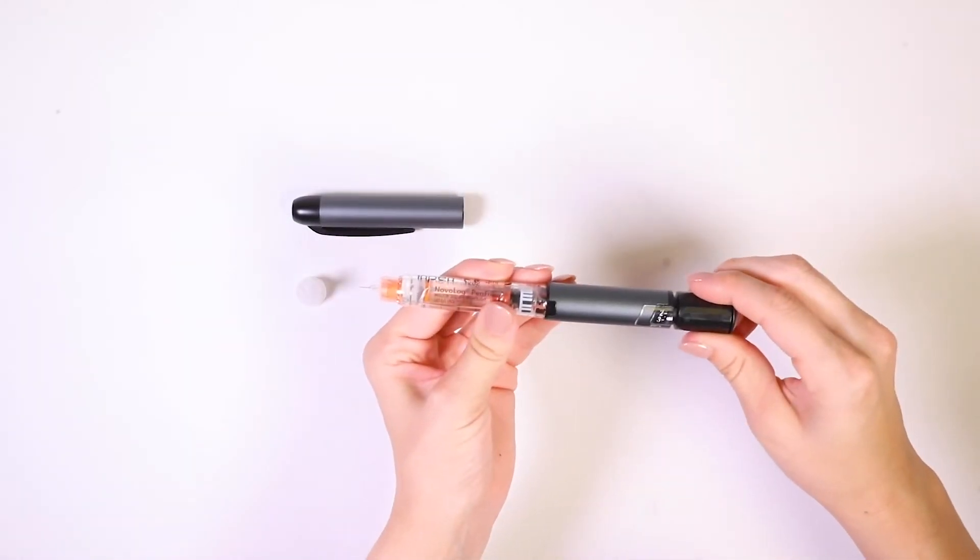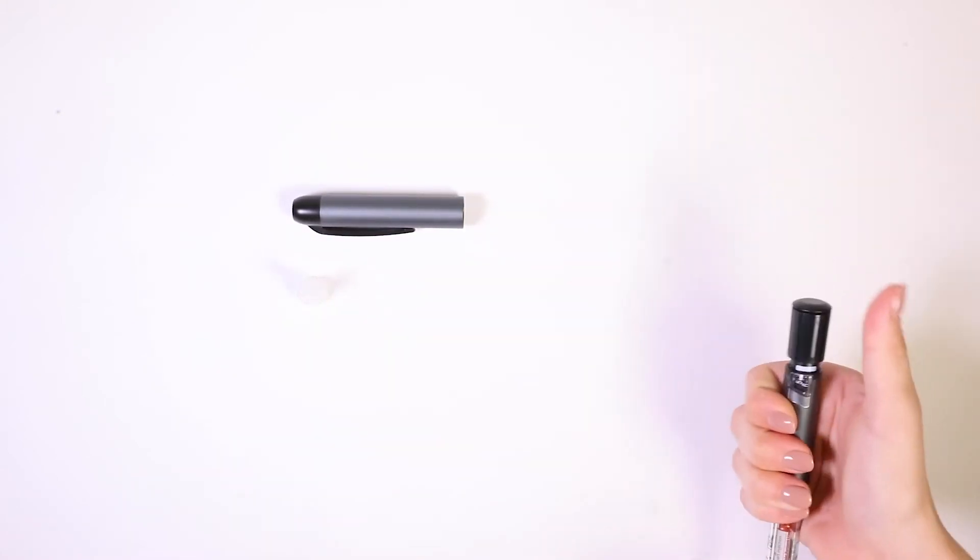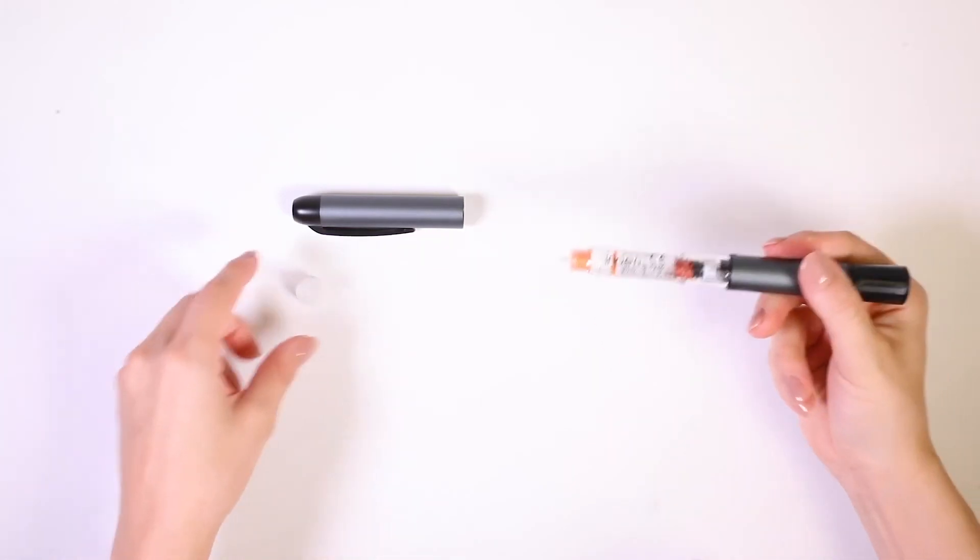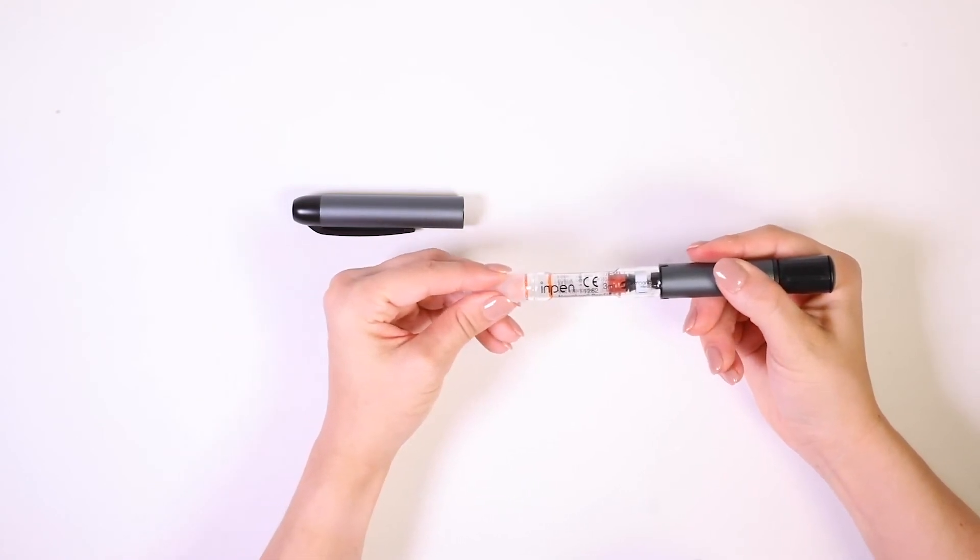To set your dose, turn the knob until the window shows your recommended dose. Insert the needle into your skin and press the button until the window shows zero. Wait for eight seconds, then remove the needle from your skin.